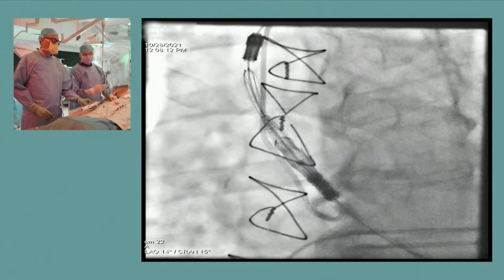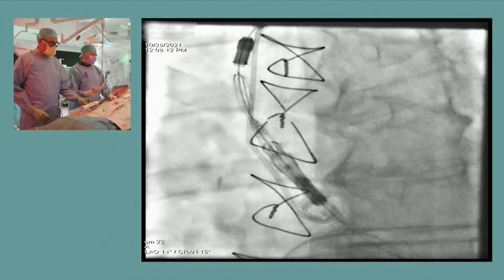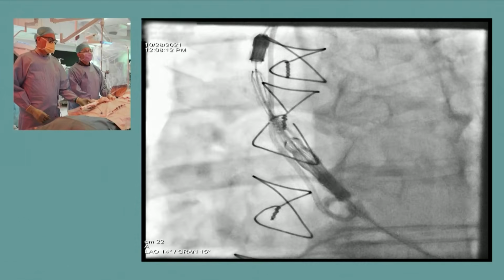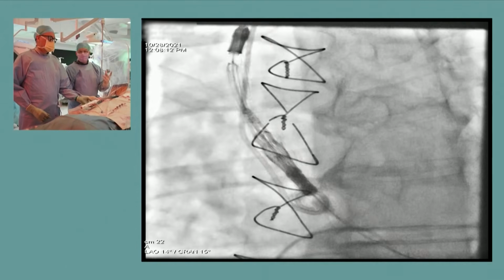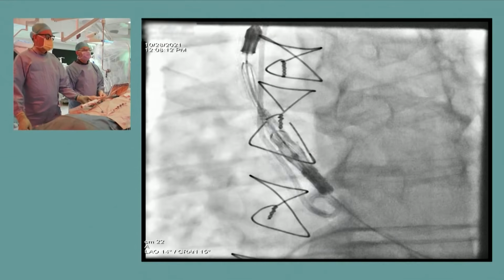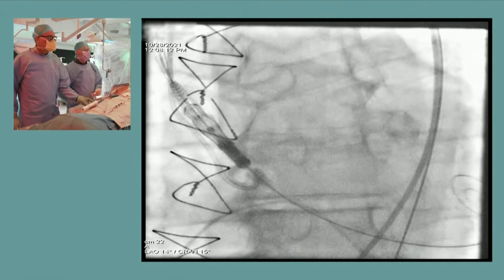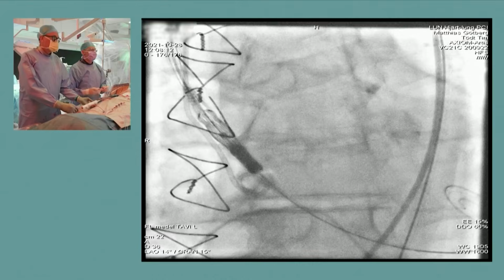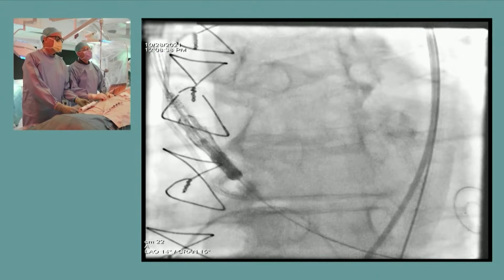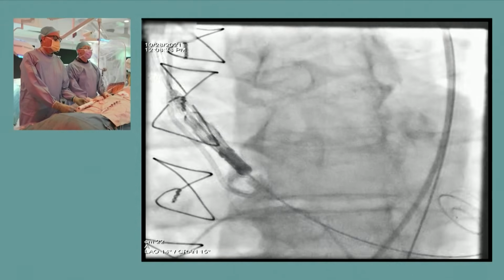We typically spend about 30 seconds doing this, so it's not really that complicated. And we try to do it in 2 steps. In other words, first we focus on the commissural alignment process, and then we venture further into the actual implantation, which is to try to separate them. So once you've finished your commissural alignment, you let go of that part. Pigtail and advance. We're just taking a little bit of time showing this.